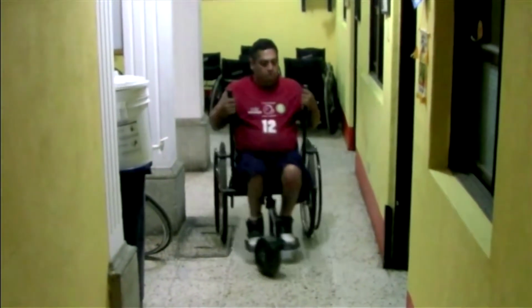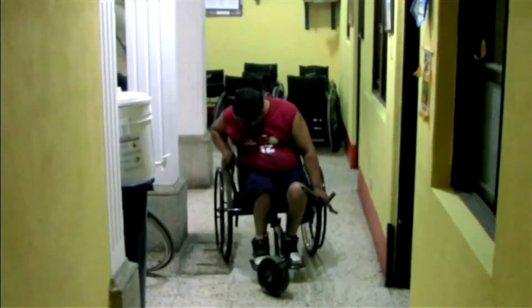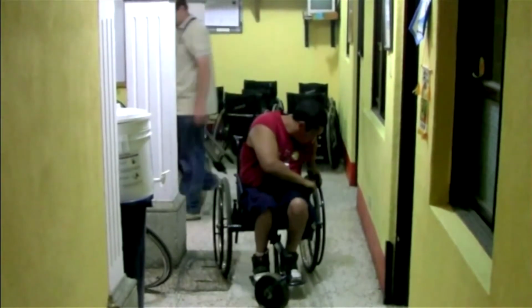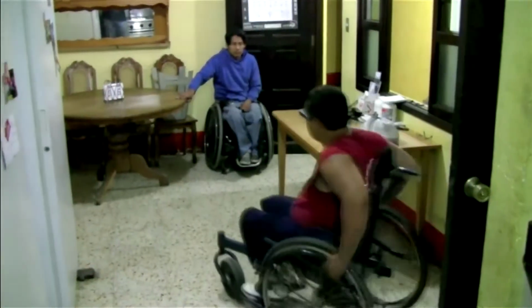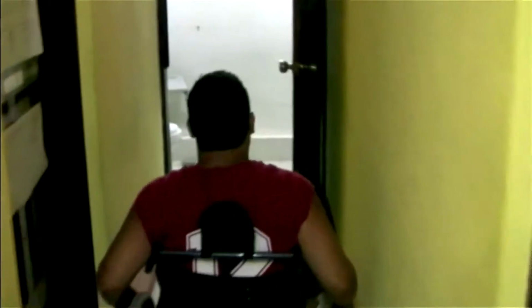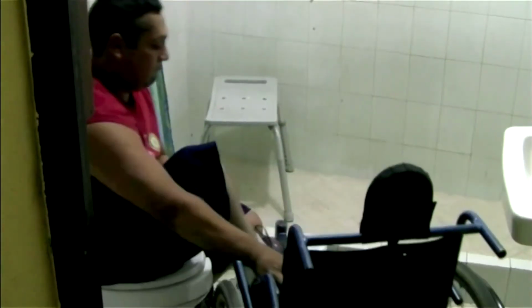When you take the LFC indoors, the levers just pop out, they pull out of couplings, and they stow in the side of the frame. And this converts the chair to a regular, conventional push-rim style wheelchair. So we had to design it small enough to fit through a standard-sized doorway. It had to be low enough to fit under a table or a desk. And we had to consider other mobility situations, like how could you get into a bathroom and get close enough to, this is a Western style toilet in this picture, but close enough so you could transfer off and be able to use the bathroom.